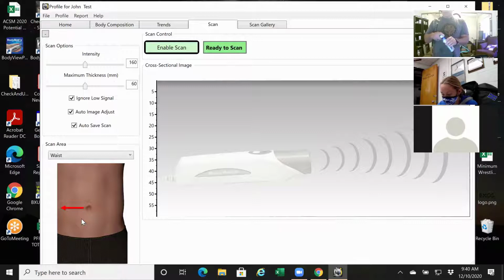Exact same thing as measure point in our one-dimensional measurements. So we can be hands-free as well performing the scan. So I'm going to just spread the gel here. My objective is to make sure the device slides real smooth and easy on the surface. And when I'm ready, I'm going to go to my site point, lift the device off the skin, click, click.